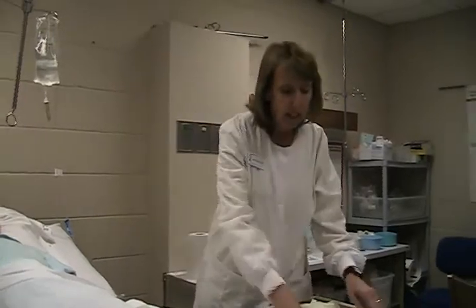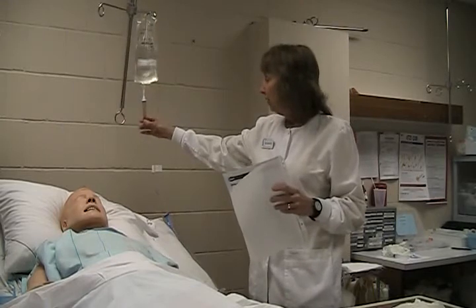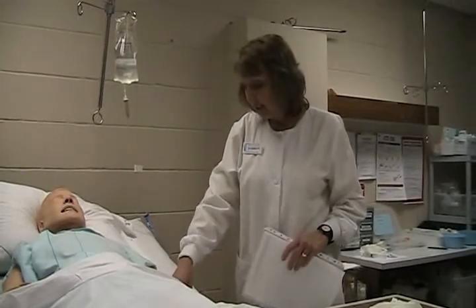During your initial approach of the patient, be sure to have your medication order with you and verify the patient's identity, as well as checking the IV solution that is already hanging, noting the type of IV solution it is, and to determine that it is running according to the prescribed rate. You will also be assessing the patient's IV site, checking for any redness, swelling, leaking, or infiltration, noting the patency of the IV site.